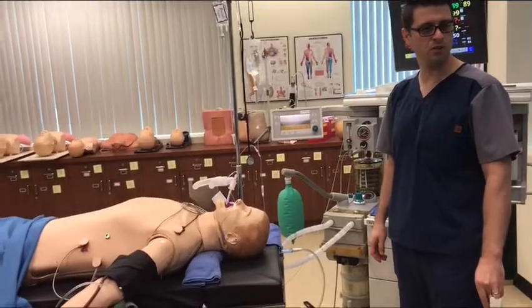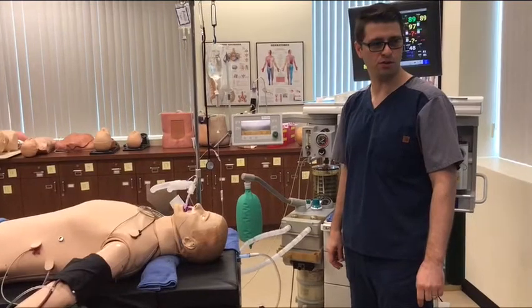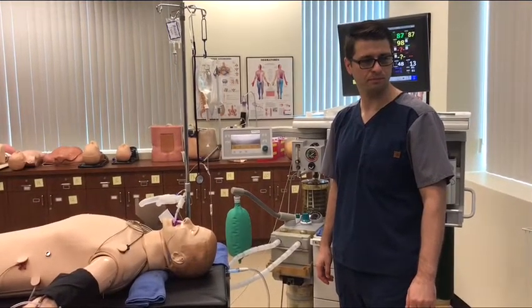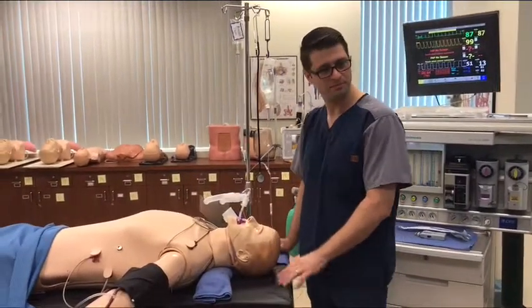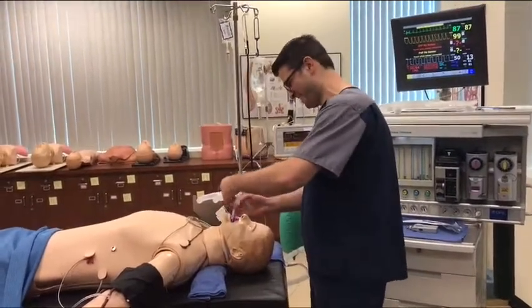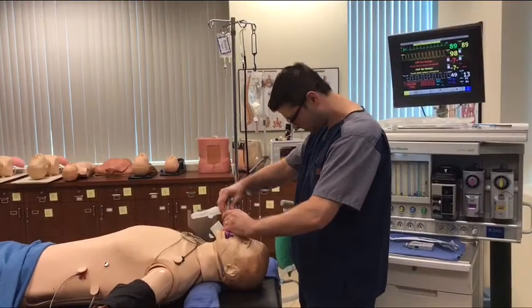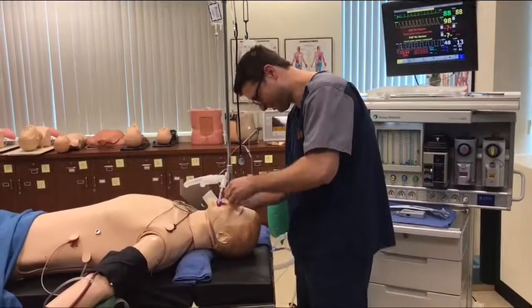Now he really wants his tube out. The nurse is coming over here, and he's trying to fight that nurse. She's really having to hold him down. He's moving now. He's trying to hit you. The more we talk, the more he's getting violent. Yeah, he's really upset now. He's trying to bite through that thing. He's probably going to break his teeth on that oral airway. He's kicking his legs right now.